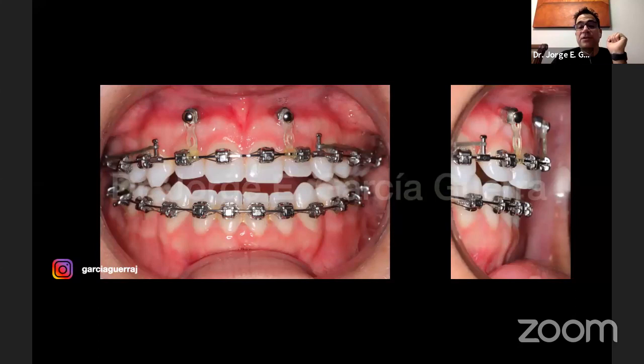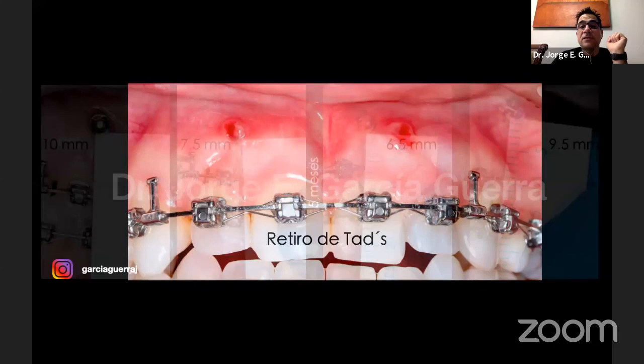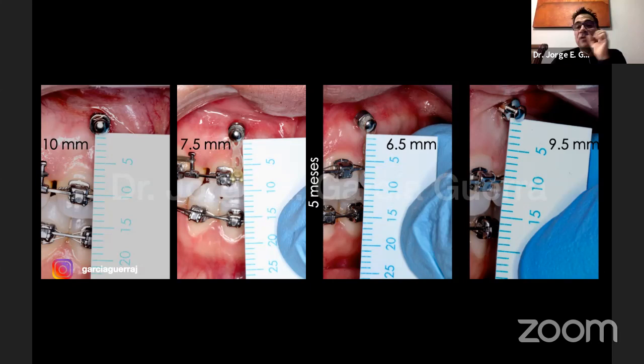Okay, we still have some little spaces, but you can see the correction. We took out the TADs, and you can see the difference: it was about 3 millimeters from the beginning to the day we took off the mini implants.